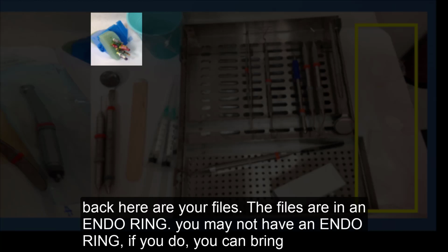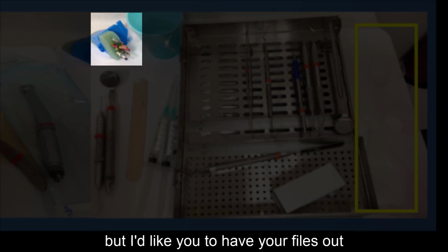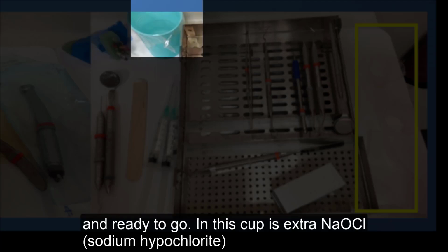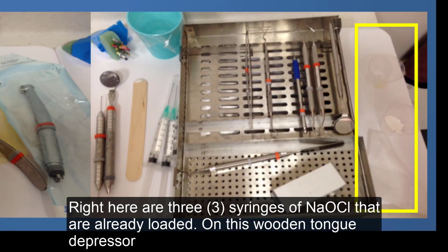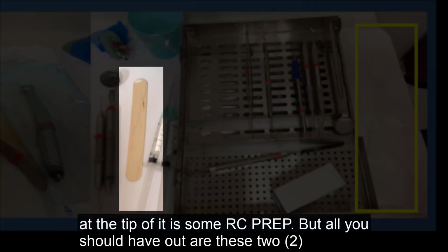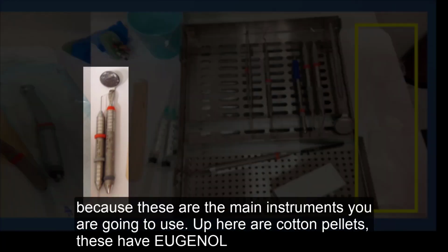Back here are your files. The files are in an endo ring. You may not have an endo ring. If you do, you can bring it. If you don't, there's a file holder, but I'd like you to have your files out and ready to go. In this cup is extra sodium hypochlorite. Right here are 3 syringes of sodium hypochlorite that are already loaded. On this wooden tongue depressor, at the tip of it is some RC Prep. But all you should have out are these 2 because these are your main instruments you're going to use.